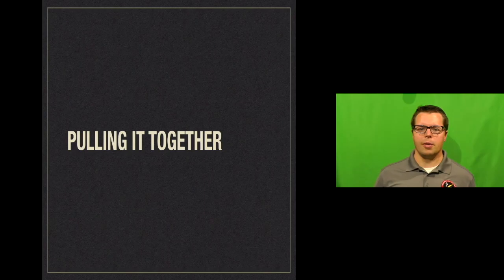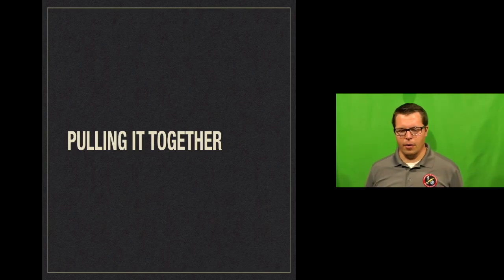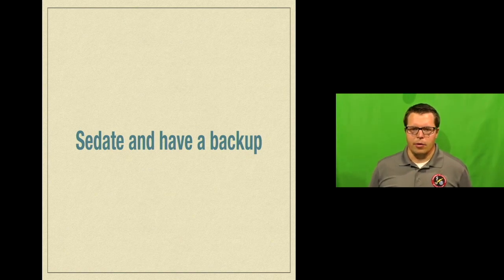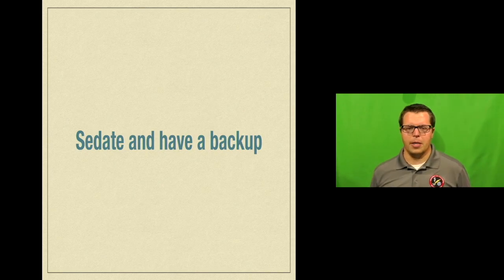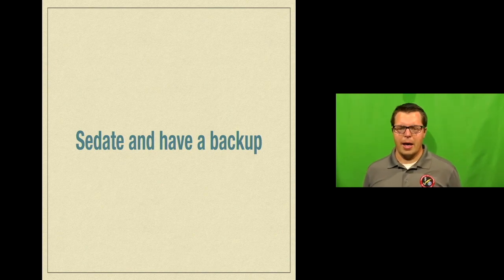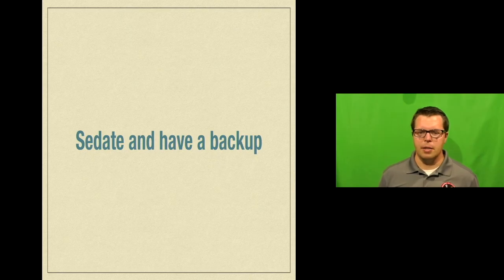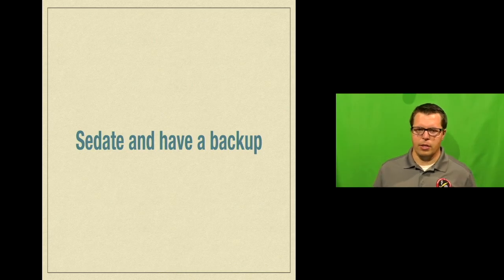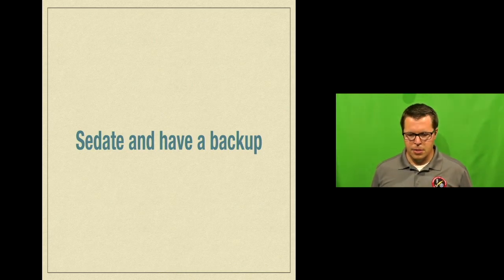So, just to summarize all that, to pull it all together, one might say, don't forget that the patient is about 50% of the ventilator circuit. If you're going to do the whole vent thing, you have to remember that the patient is part of that setup. So make sure the patient is at least comfortably sedated, you know their physiology, you know something about them, and have a backup plan for how you're going to keep them asleep during transport, because you don't want the Hulk waking up and smashing up the back of your ambulance after he extubates himself.